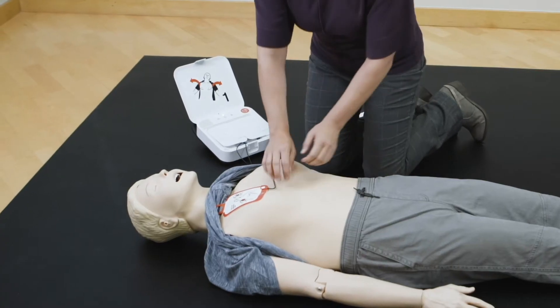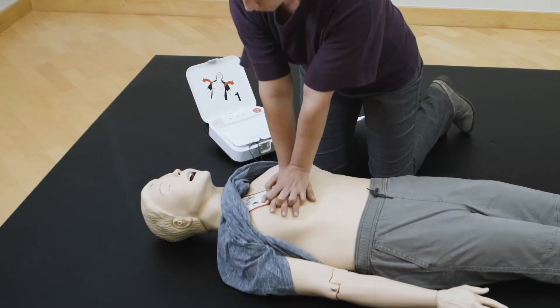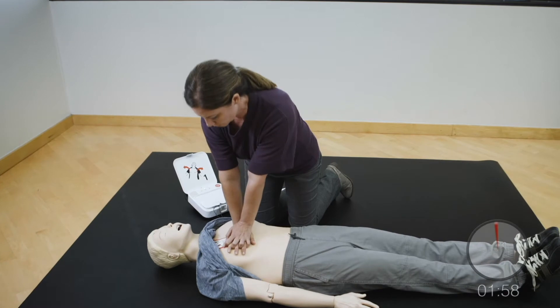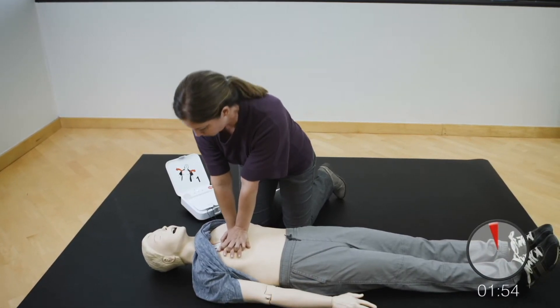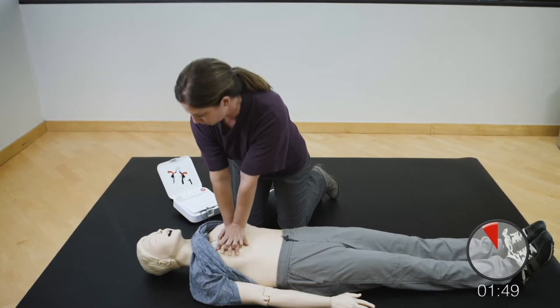Provide chest compressions to the beat. The heel of one hand should be in the center of chest. The other hand should be on top of the first hand. Push down hard at least two inches. Provide two breaths.